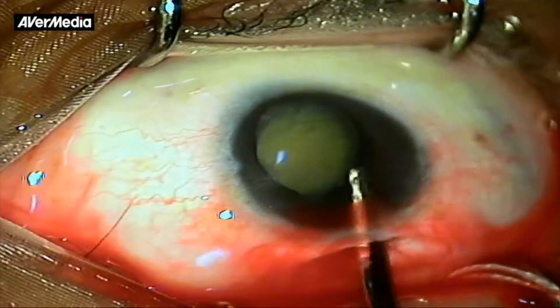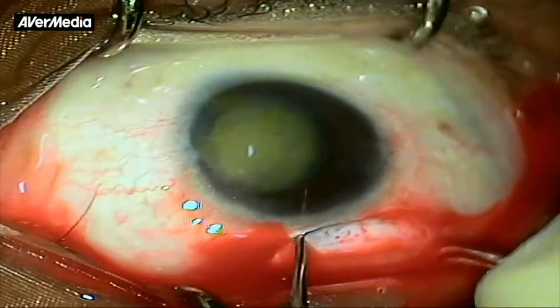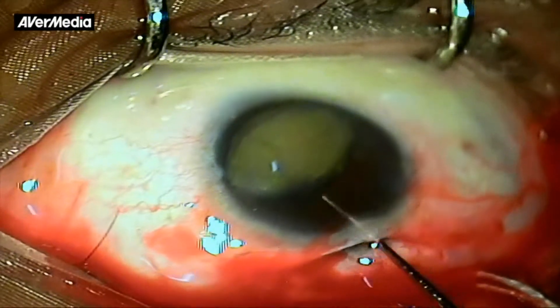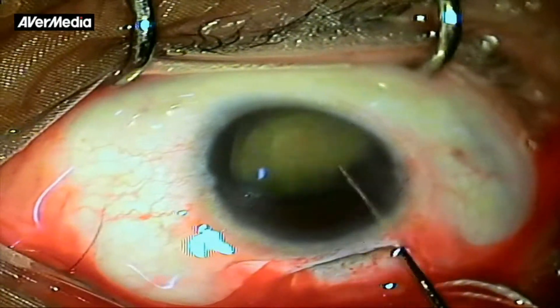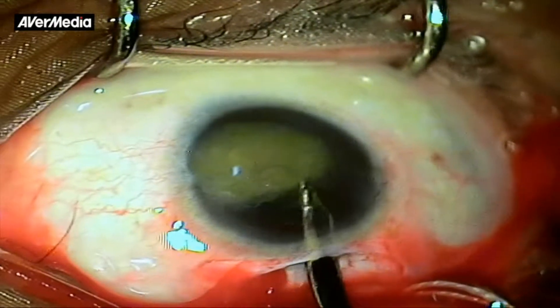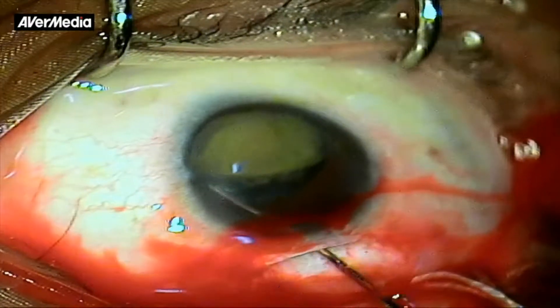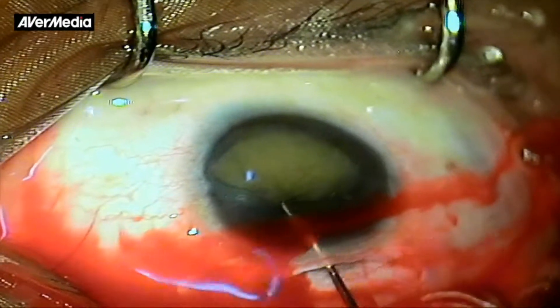The nucleus was debulked with some aspiration of cortex to ease nucleus prolapse and delivery. More cortex was removed from around the equator. An attempt was made to prolapse the nucleus into the anterior chamber — it was simply rotating in its place but refusing to come forward. More cortex was removed from around the nucleus to debulk it further, but despite several attempts, it was not possible to prolapse the nucleus into the anterior chamber.